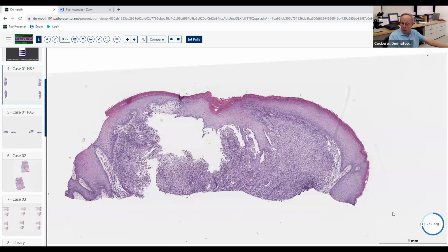Good, good, excellent. So at low power, that's kind of what you're saying. It's just general information. Sometimes you can make a specific diagnosis at low power, but sometimes you're just getting a general lay of the land. So yeah, we think it's inflammatory. We don't really think it's neoplastic. And you say there are some purple cells.